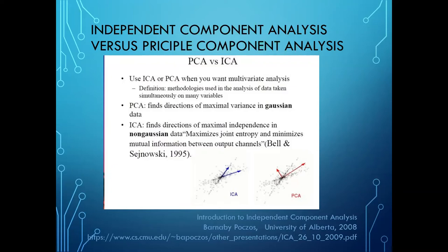In the WinEEG, it's not the best form of ICA. The ICA for de-artifacting of eye movement is called fast ICA. And fast ICA takes out the biggest component and sets it aside and then looks for the next biggest component. It doesn't do it in parallel, it does it serially. And by the time you've picked your top handful of components, which are fairly accurately identified, the lack of being done simultaneously means the last handful of components out of the 19 end up being pretty spotty. Their spatial topographies aren't distinct or discrete. They haven't maximized the separation of components.